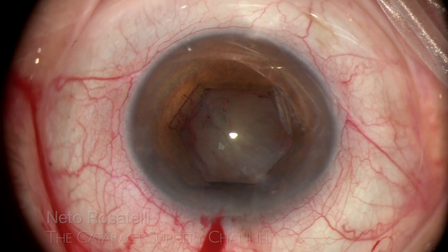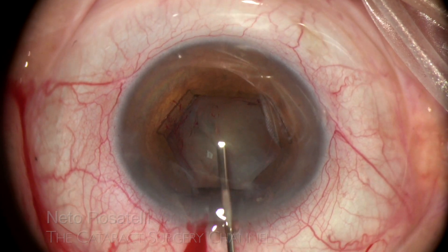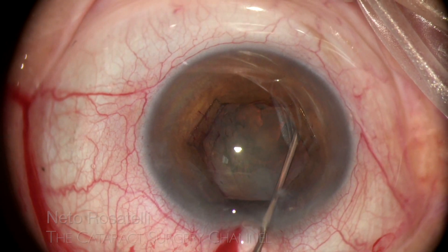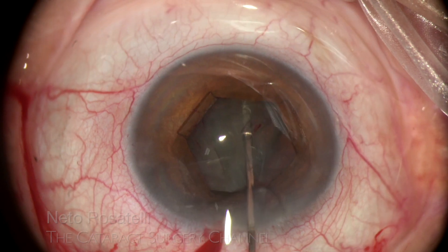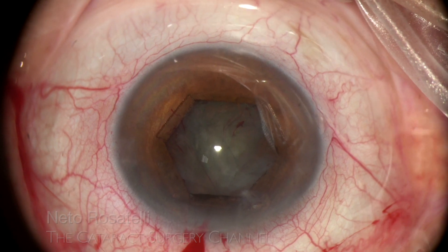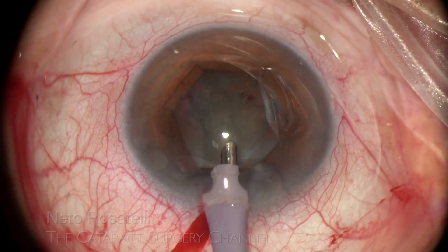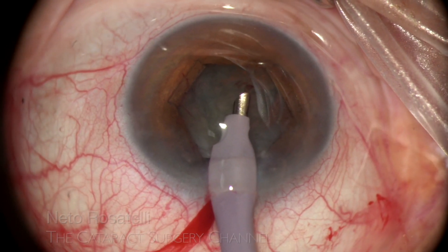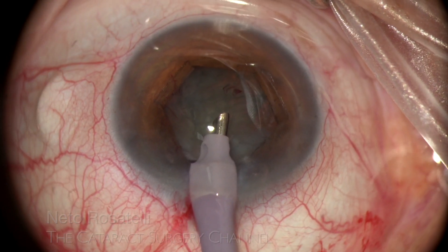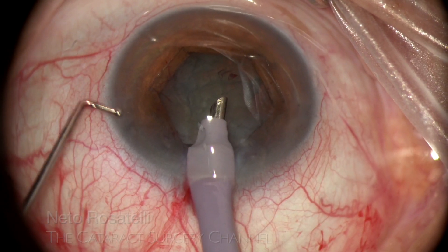Next comes hydrodissection, very important here to later facilitate cortex removal, which is made more difficult due to the small pupil that hinders peripheral visualization. Fortunately, it is a relatively soft nucleus, and I expect no difficulty in its management. In small pupil cases, I like to make an initial trench, like in the stop-and-chop phaco technique, to immediately gain space and ensure an easy nucleus division, facilitating management in a restricted space environment.